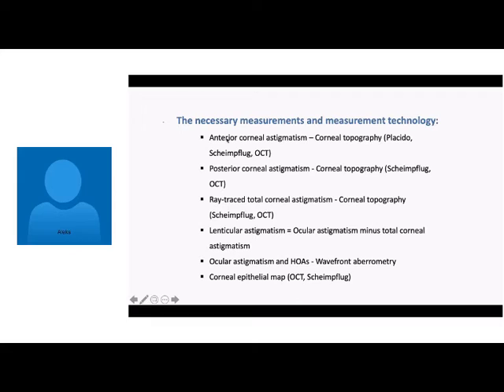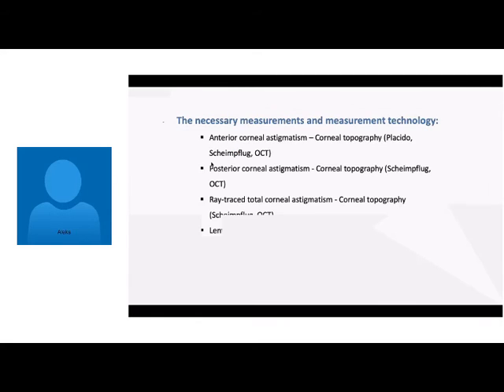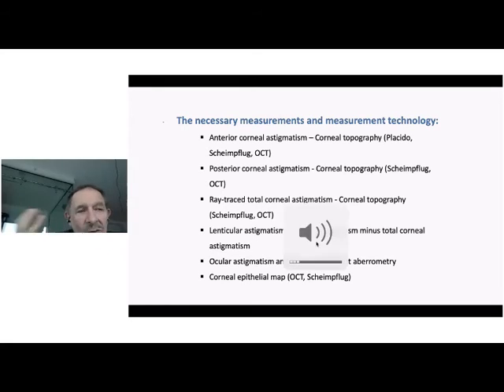So the necessary measurements and methodology. Oops, sorry. Presentation, posterior corneal surface, lenticular factors, just a guide, not some program or treatment.